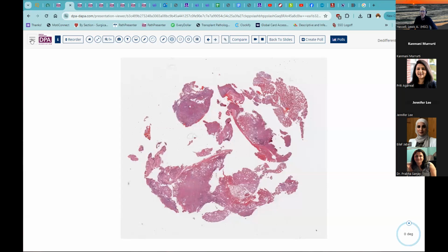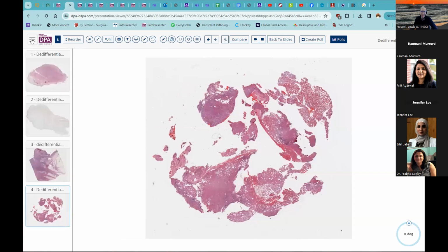So it's very common for this tumor to occur in Gerota's fascia around the areas of the kidney and the retroperitoneum and so forth. And as you know, excision or removal of these tumors is extraordinarily difficult just because boundaries are essentially impossible to define.